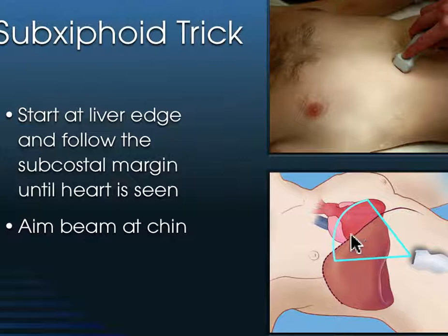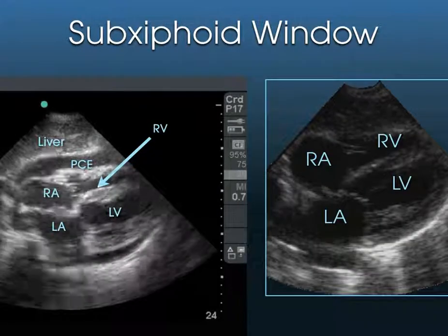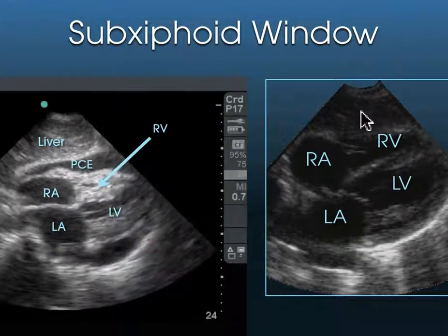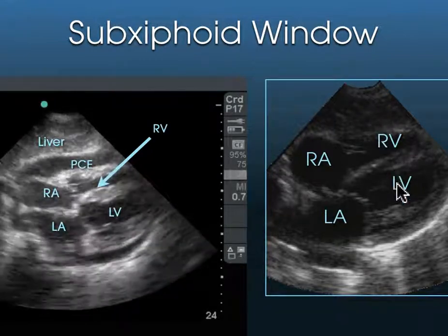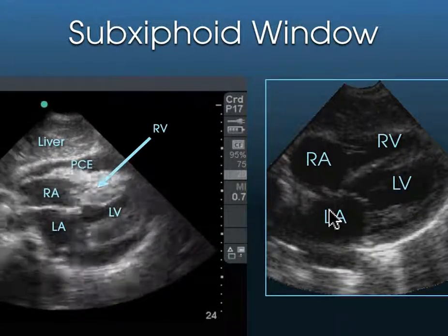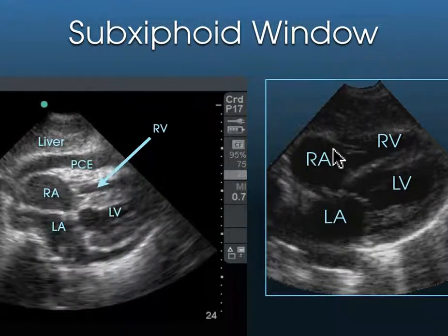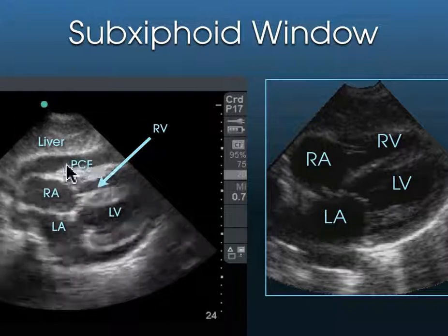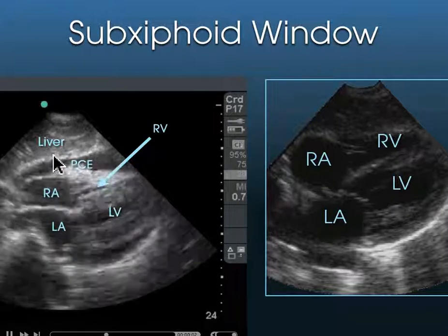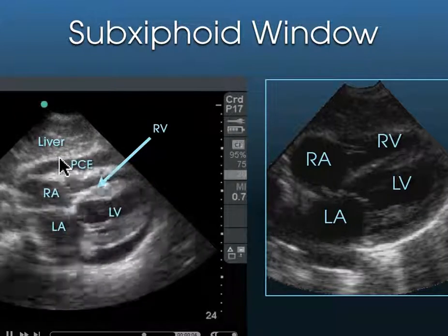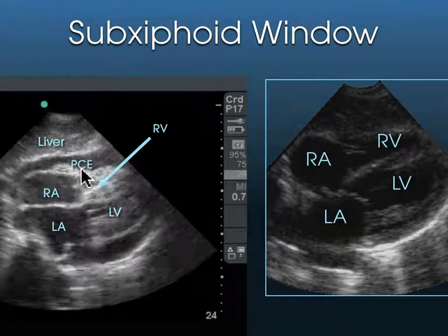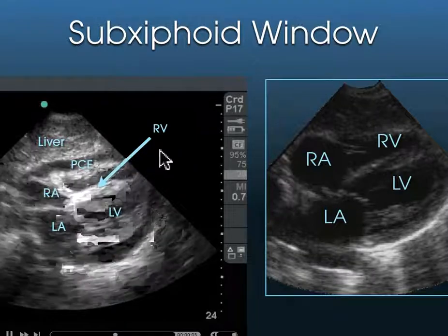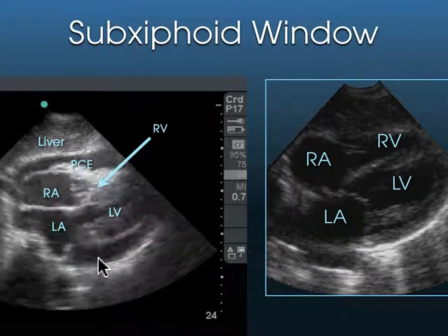In order to get the liver to come out from under the ribcage towards the probe, have the patient take a deep breath. In the sub-xiphoid view we see the following: here's the liver, then the right ventricle, then the left ventricle. Here's the right atrium, and here's the left atrium. The right side of the heart is closer to the liver, whereas the left side is further down. Once we have a pericardial effusion, it's seen as a separation between the anterior pericardium and the myocardium — in fact this effusion is all the way around, including the posterior region.